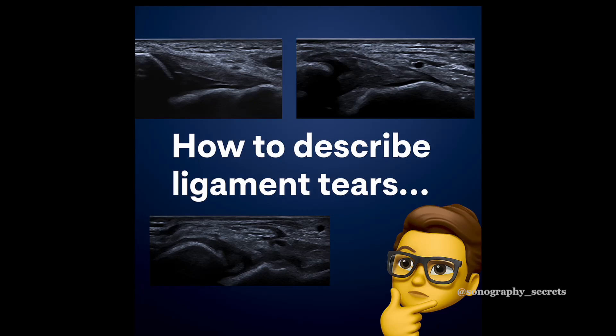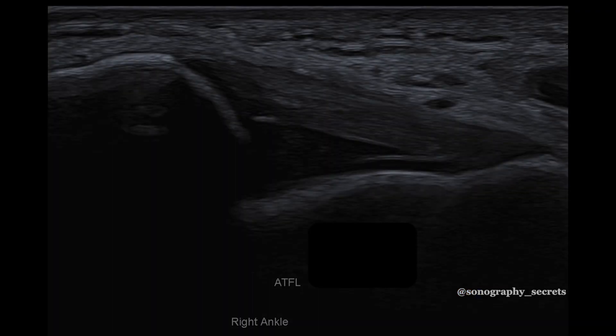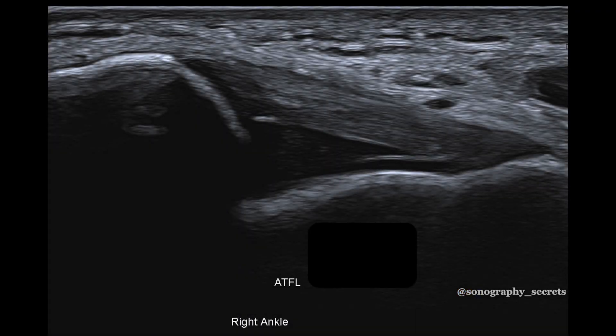There are two parts to ultrasound — image acquisition, which is the easy part, and image interpretation, which is the hard part. This holds true for ligament injuries. Arguably the most common injured ligament we encounter is the ATFL.